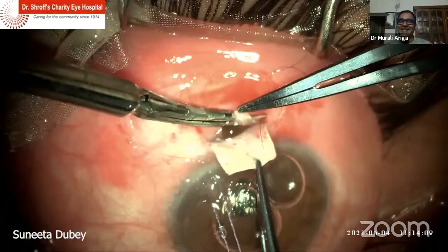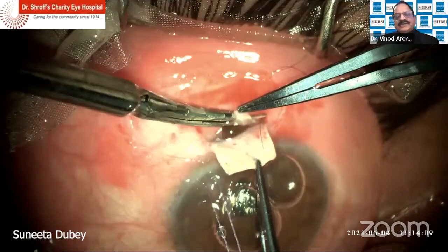Basically, it comes as a bolus. It comes as a bolus. Even for AC reformation, we also use Hylon, sodium hyaluronate. Or gel, or what? Okay, so I think I'll show the second.